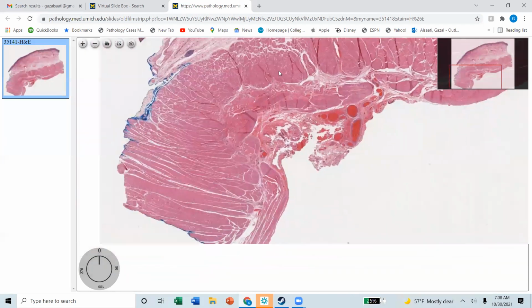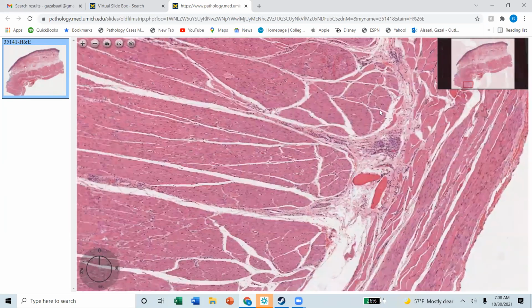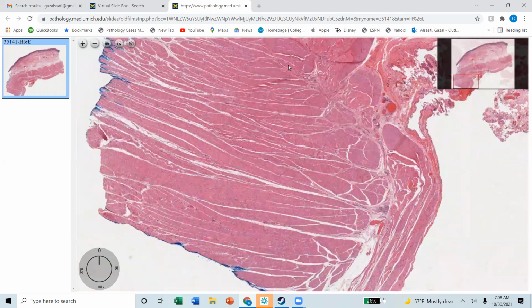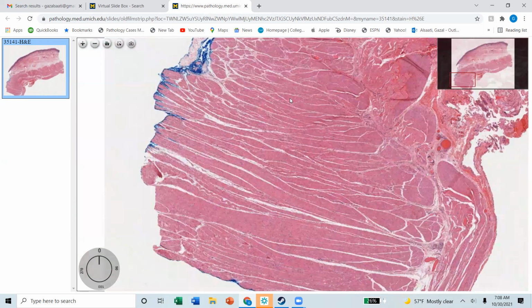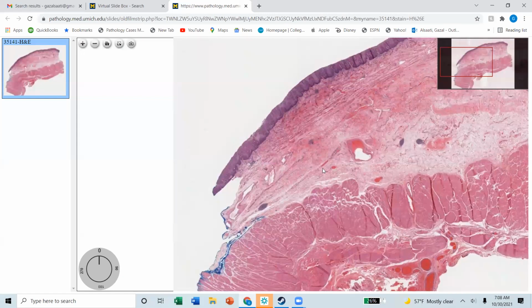And you will basically have the myenteric plexus. I mean, we should have some here. It's not completely lost, but usually there is no myenteric plexus. Sometimes the nervous component is very, very, very decreased, and so it will fail to relax.